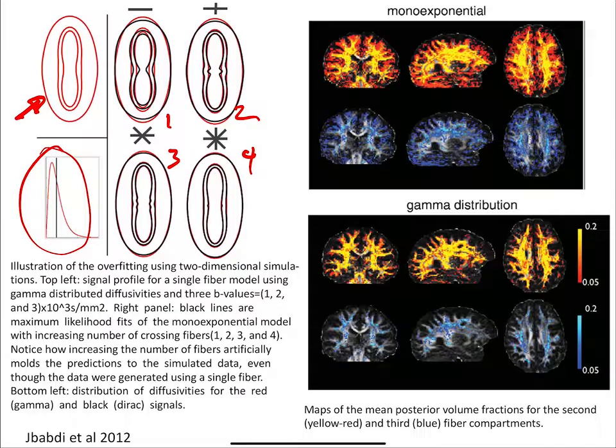Okay, so that's what bedpost tries to do. So this is shown here where, let's see, what is this for a second, and blue third fibers. Okay, so this is the mono-exponential. So this is, how many voxels have 2 and 3 fibers in it. So that's if you didn't take into account the fact that there's different diffusion compartments.